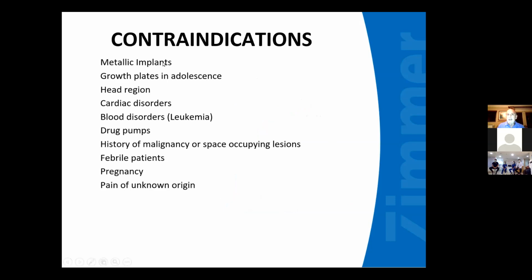Contraindications: doesn't feel good over metallic implants. It's not generating any heat, so don't worry about that. But the contractions are so strong, it just doesn't feel good to the patient with a joint implant. As a rule of thumb with electrotherapy, we always try to avoid growth plates in adolescents.